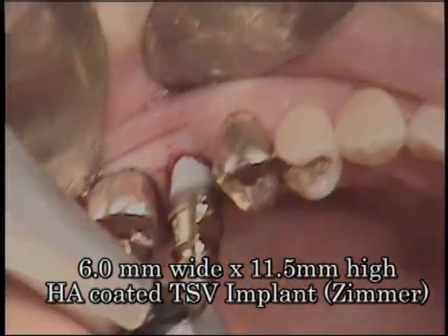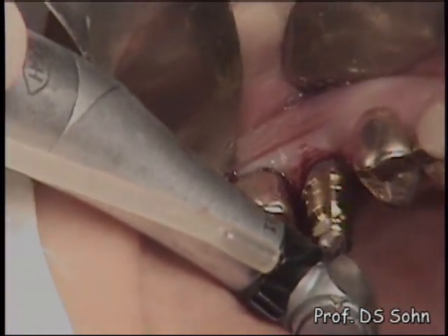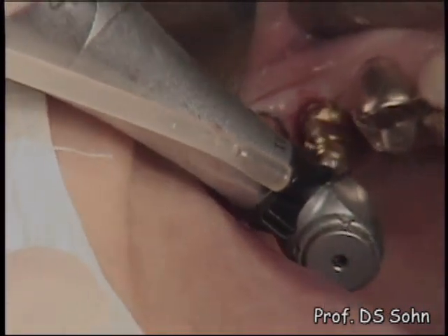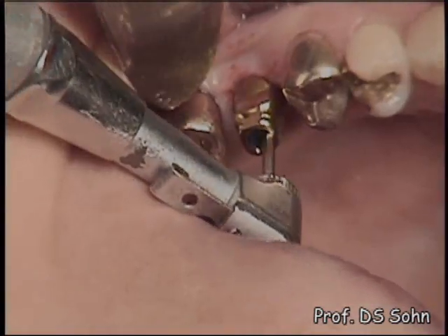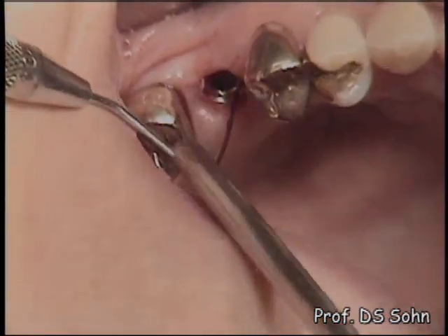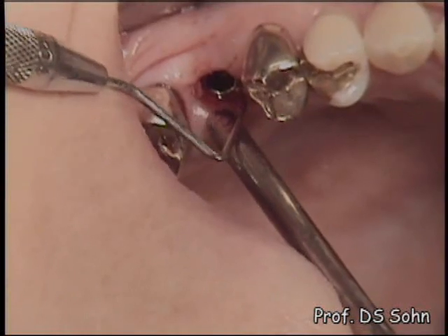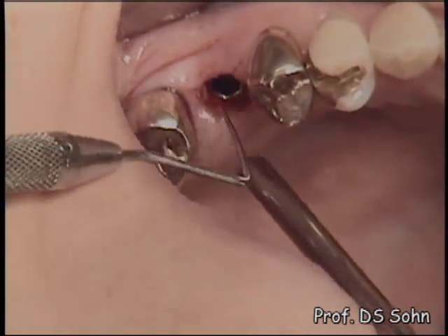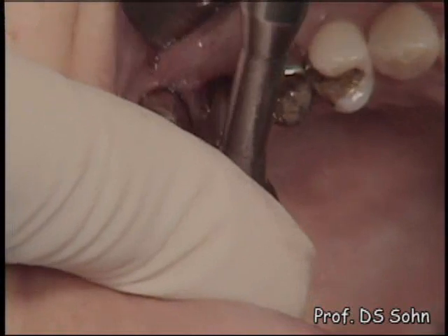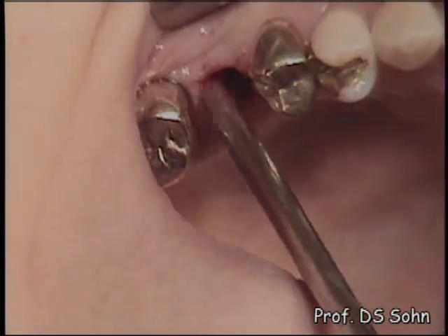A 6.6mm wide and 11.5mm high HA-coated tapered screw-vent implant was selected and placed with good initial stability. The implant mount was removed and the position of the implant platform was measured using a periodontal probe. This implant was placed slightly supra-crestally, then repositioned sub-crestally using a ratchet adapter and wrench.